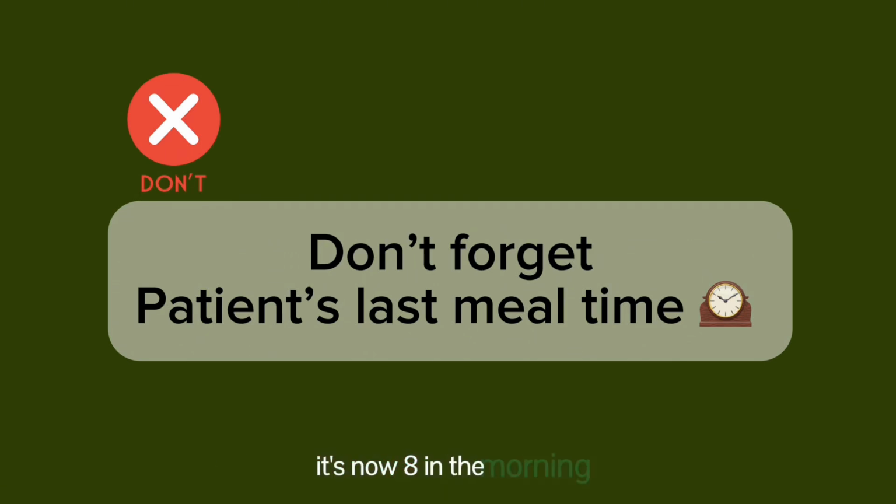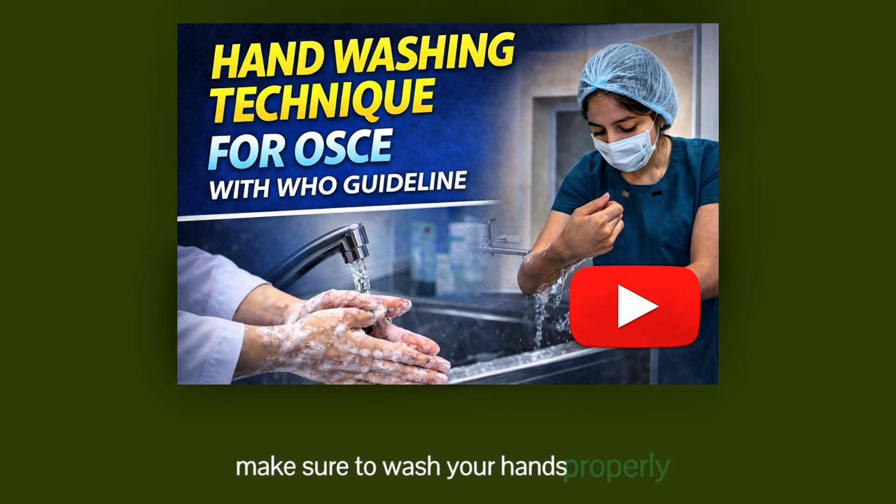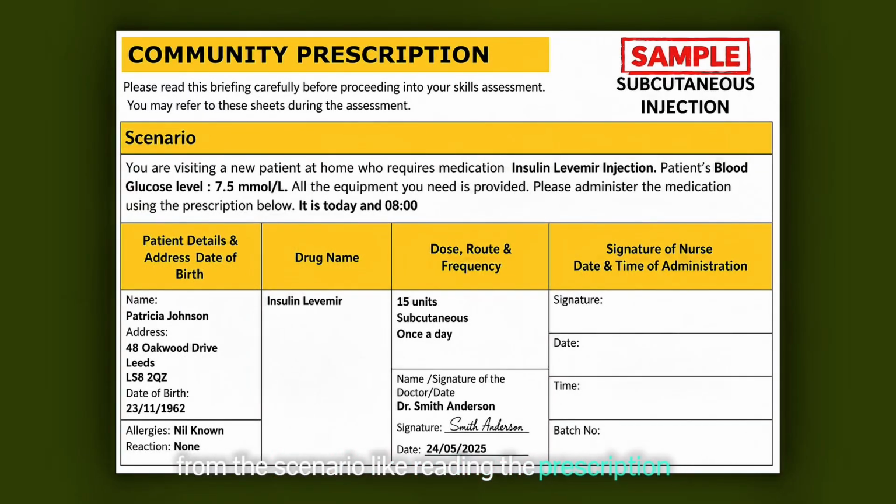It's now 8 in the morning, so I'm going to prepare the articles now. I will be right back. Patricia, if you need me for anything else, just press this call button. Is that alright? Now make sure to wash your hands properly according to the WHO guidelines. Now you have to read the prescription sheet from the scenario, like reading the prescription sheet in the implementation station.